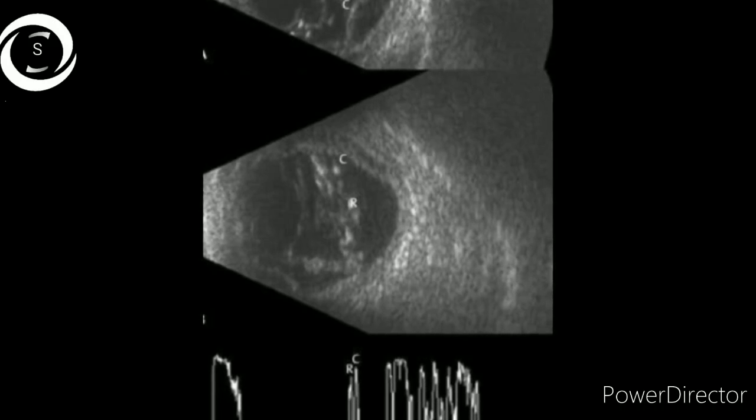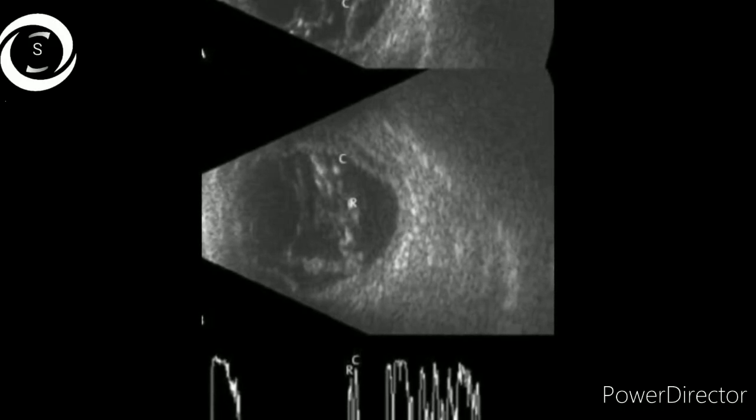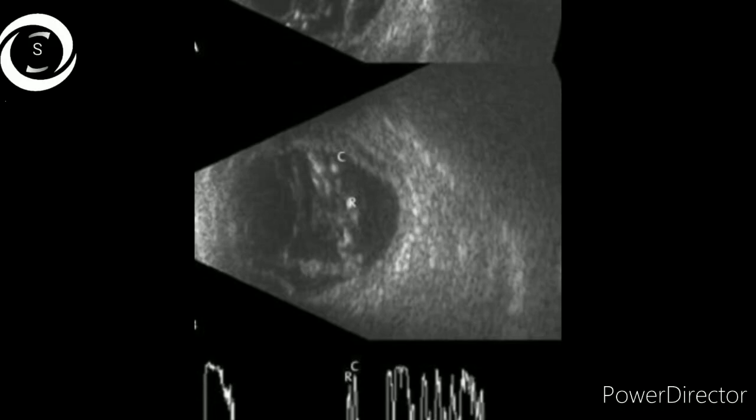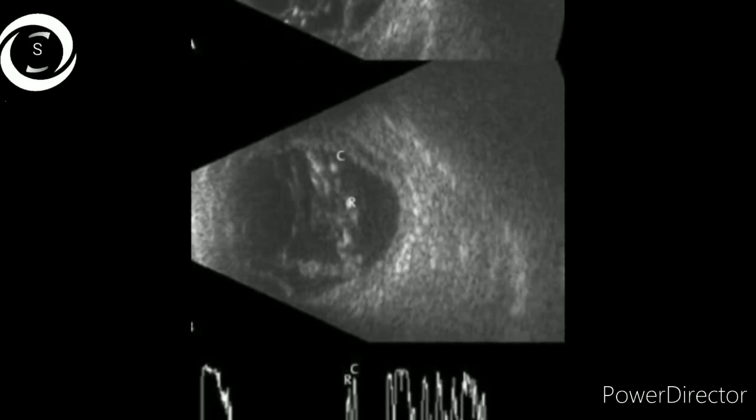In the last B scan, 'P' denotes PVD anteriorly, 'R' denotes retinal detachment, and 'C' denotes choroidal detachment. In this B scan you can appreciate posterior vitreous detachment, retinal detachment, as well as choroidal detachment simultaneously. That covers all the detachments in B scan — thank you very much.